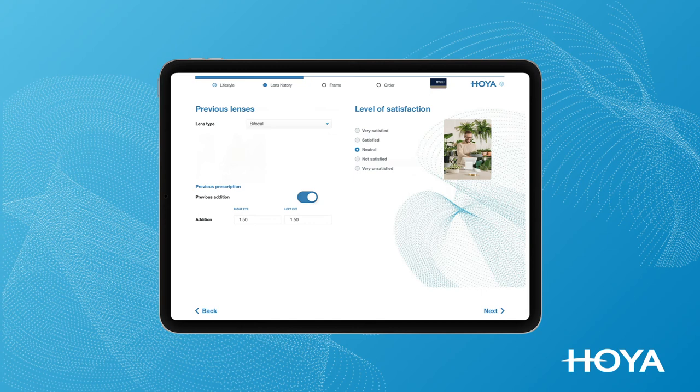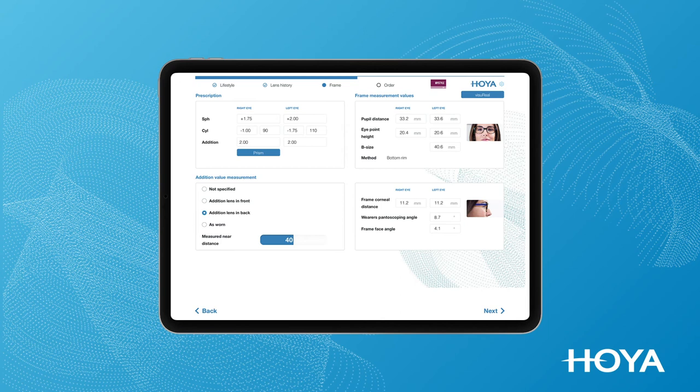Finally, you can enter new prescription details and complete the process with additional measurements, frame material and ordering.